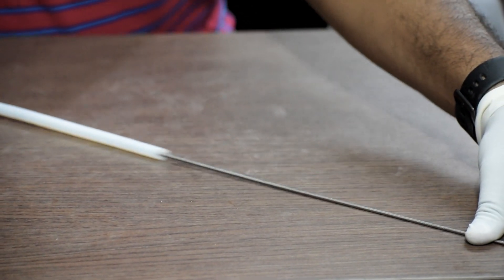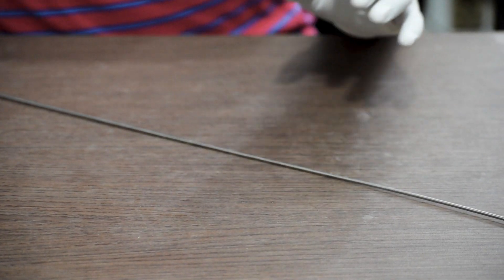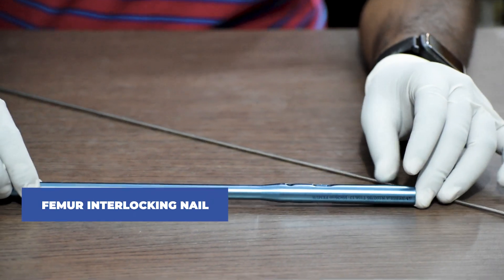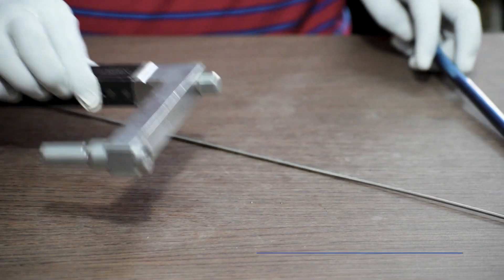Once the exchange has taken place, we remove the medullary tube and the normal guide wire stays in. Next, we will measure the length and diameter of the nail required. Once the measurement is taken, we will connect the nail with the femur interlocking jig.